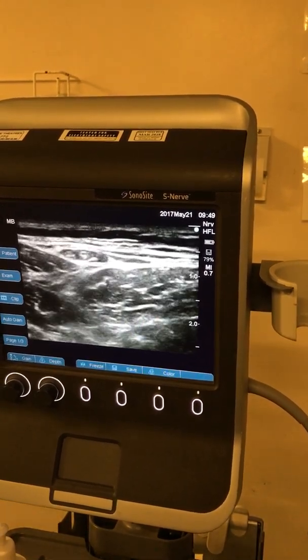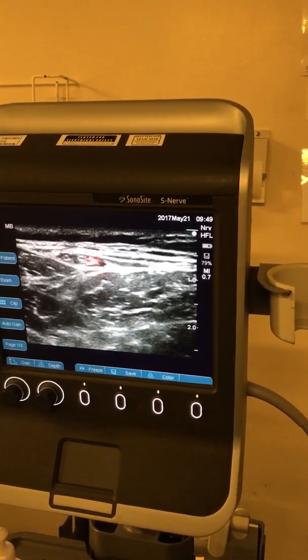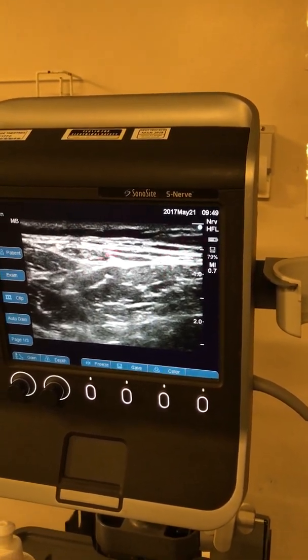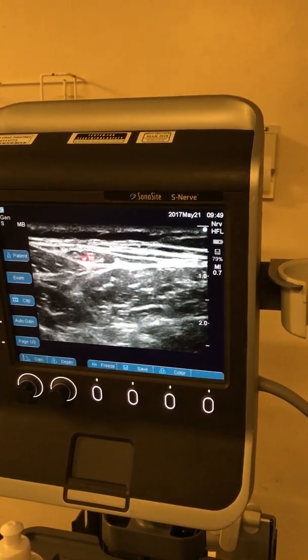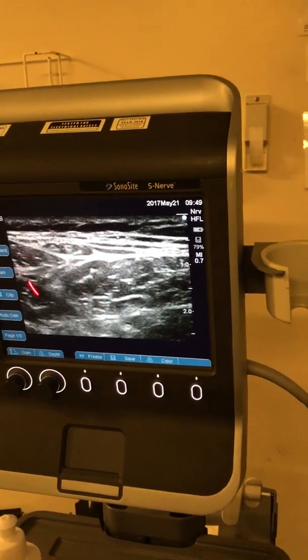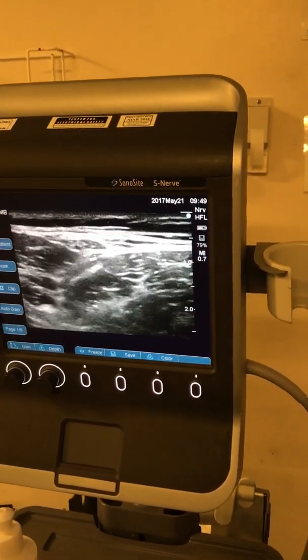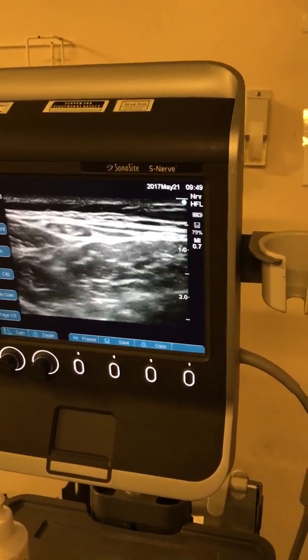If I have to do the pulsed radiofrequency, this is the area I will do it, because I can see the nerve much more clearly here. You can actually bring the needle and just do the pulsed RF. You can see the nerve is already divided into one, two, and three branches. This is one of the most variable nerves in the body, and this is the easiest way to find it.